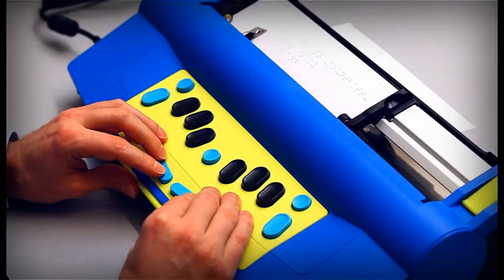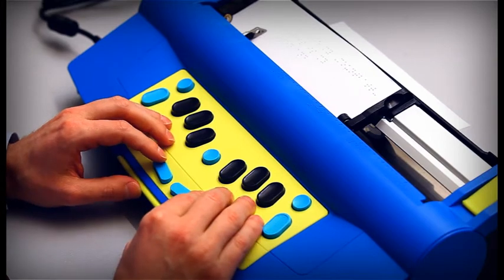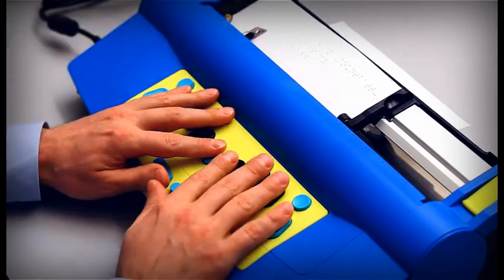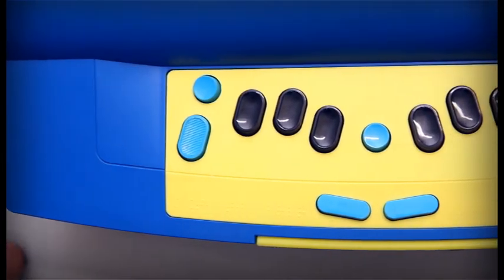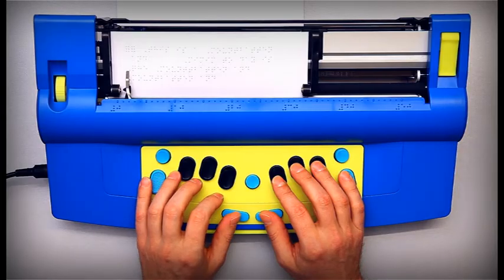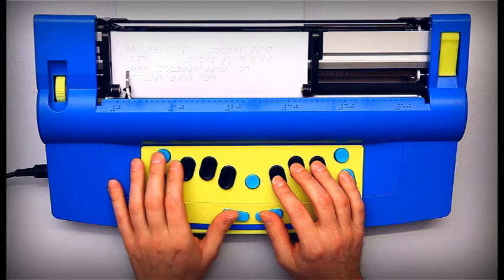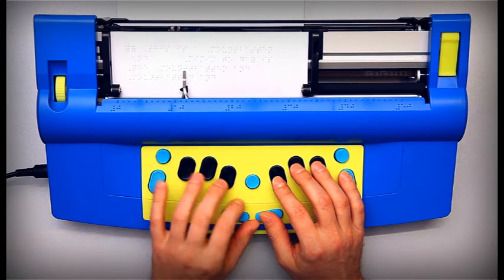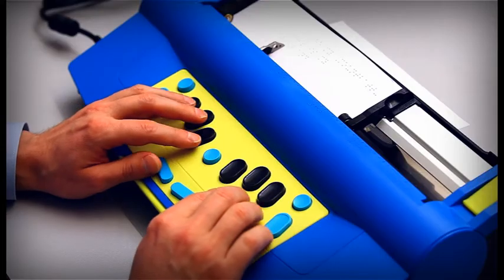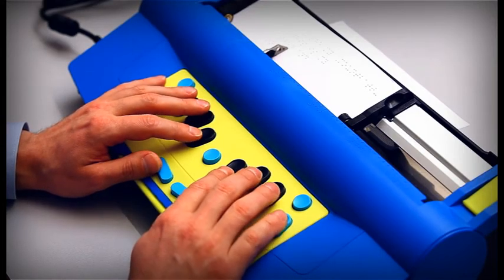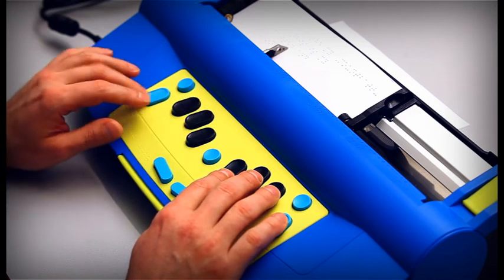There are four other keys that help with navigation and typing. Keys with the same functions are found in standard computer keyboards. Tab moves right five spaces, back tab moves left five spaces, space moves right one space and backspace moves left one space.